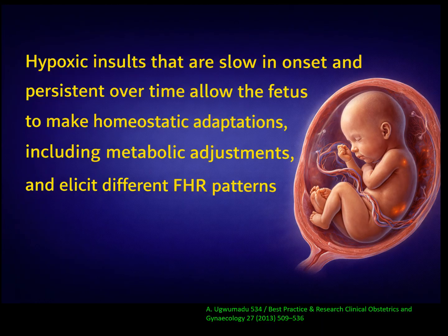Hypoxic insults that are slow in onset and persistent over time allow the fetus to make homeostatic adaptations, including metabolic adjustment, and elicit different fetal heart rate patterns. Let us look at the journey of chronic hypoxia and asphyxia, how it occurs.